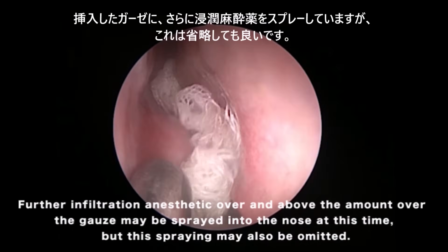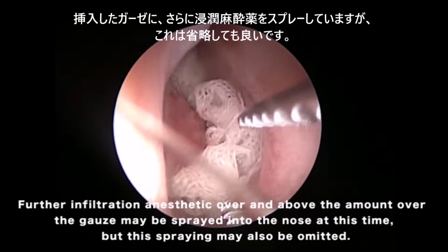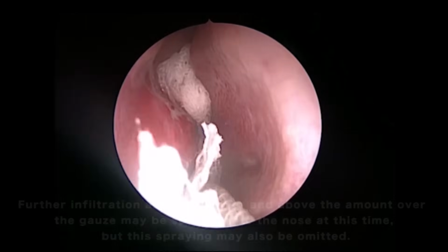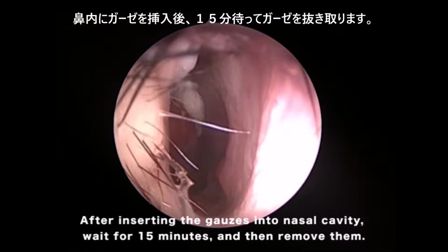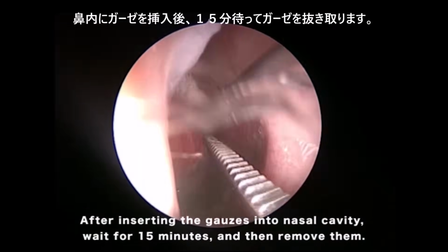Further infiltration anesthetic over and above the amount over the gauze may be sprayed into the nose at this time, but this spraying may also be omitted. After inserting the gauzes into the nasal cavity, wait for 15 minutes and then remove them.